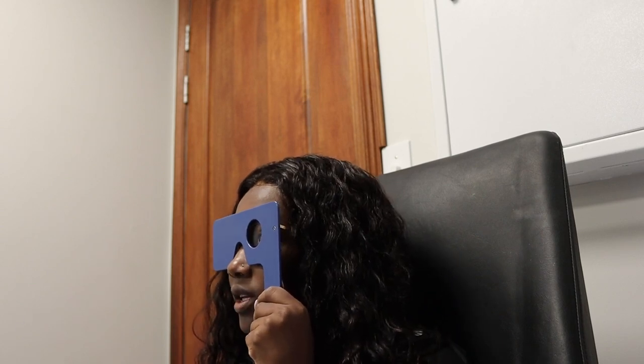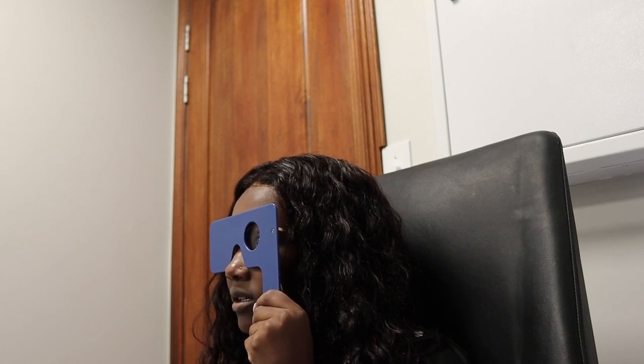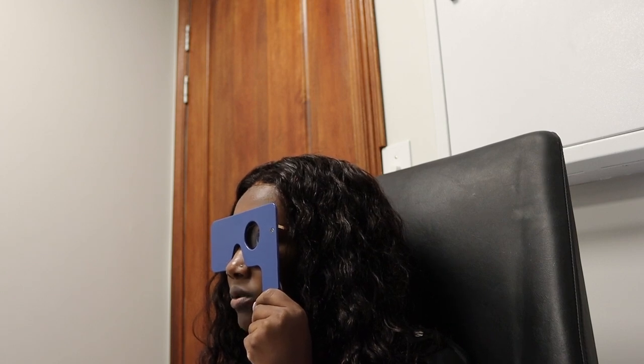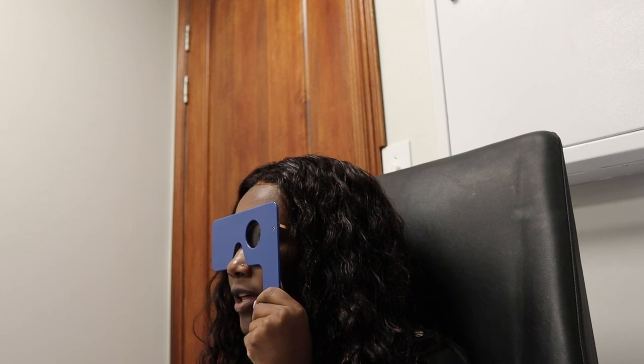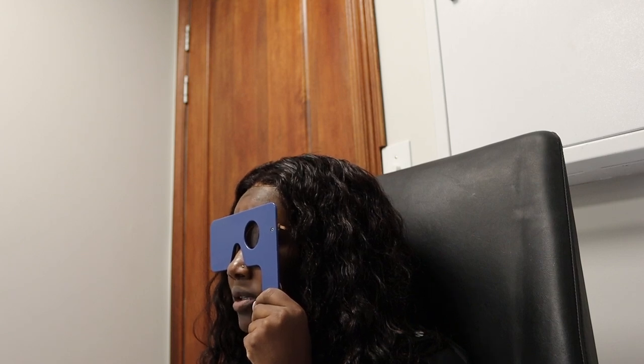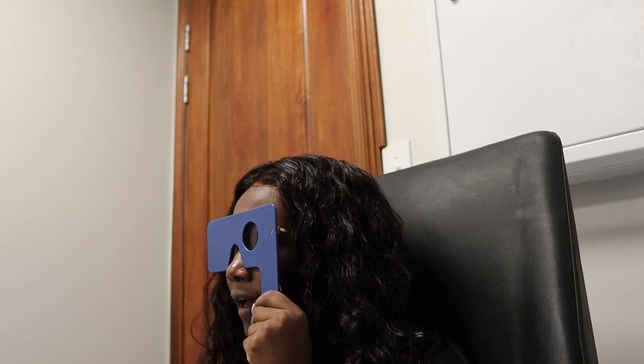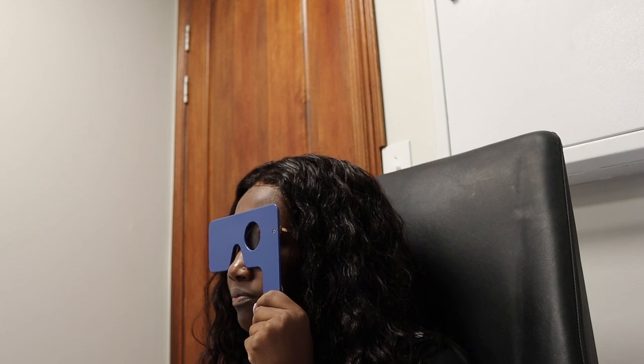And then read there. It's K-G-T-R-A. Yeah. H-E-S-V-D. Yeah. B-C-A-L-O. And over there. N-F-D-P-R. And over there. K-O-V-H-E. And over there. O-O-A. Mm-hmm. I think that's a B. Mm-hmm. I think that's an O there. And those? O-V-F something E. Okay. You can put that down.